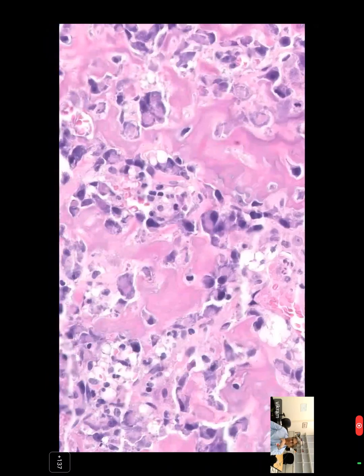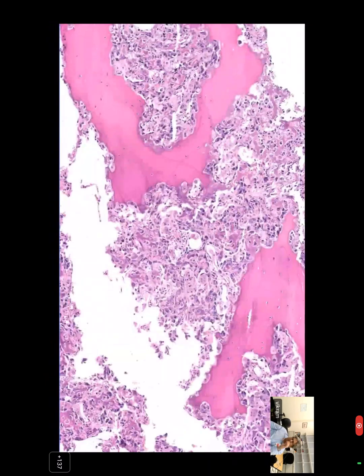But the reason why this is an osteosarcoma is because the tumor is infiltrating lamellar bone. And I can't emphasize this enough. This is such a useful feature to distinguish between benign and malignant. And you have to be absolutely sure that the bone you're calling infiltrated is truly lamellar. So you need to go down on high power and make sure that you're seeing these parallel lamellae. Crank the condenser up and down to make sure that it's lamellar bone. Once you're absolutely sure it's lamellar bone, then if you see tumor transgressing through that lamellar bone, that is malignancy.